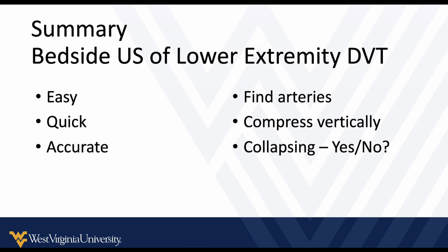So last little bits of summary. This is an easy exam. It's quick. It's accurate. It can be done in a few minutes at the bedside and make you much more efficient. Make sure you're always finding the deep arteries. Try to compress those veins vertically. And your main question is the vein collapsing, yes or no? If it does not collapse, then there's probably a thrombus in there.